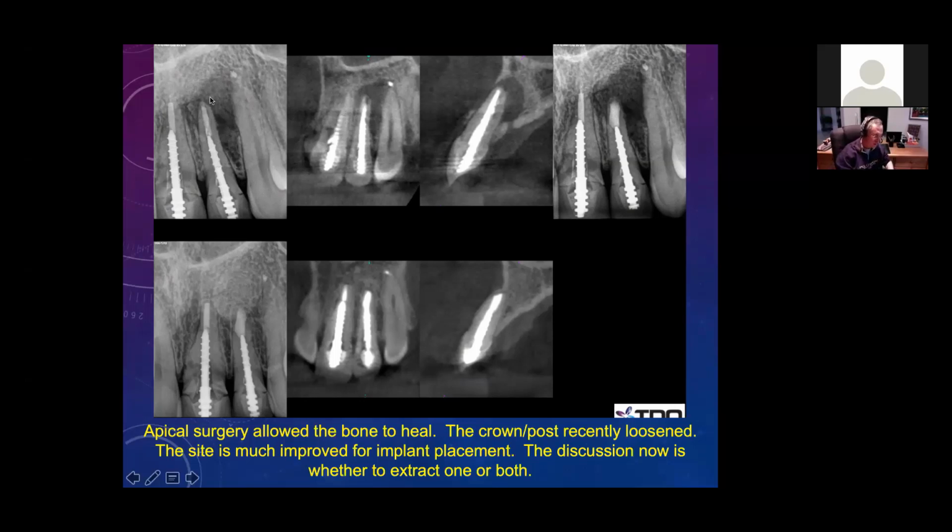I've asked a lot of implant surgeons over the years if they have a preference of grafting a native bone or a grafted bone. I think without exception, they've said they prefer to graft in native bone. So we have a number of situations where we try to regrow the bone in anticipation of implants. That was the case here.